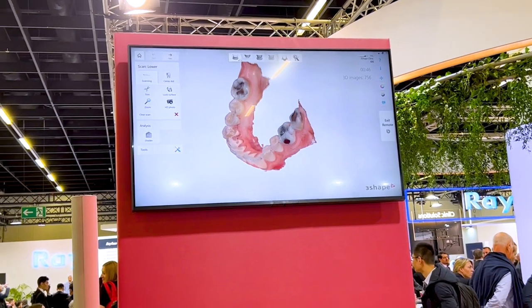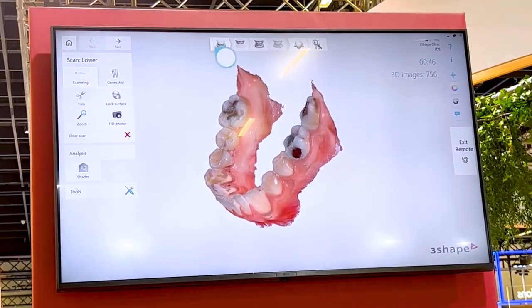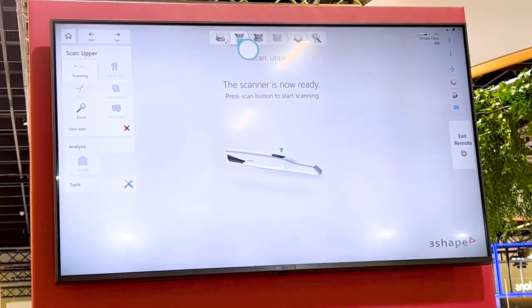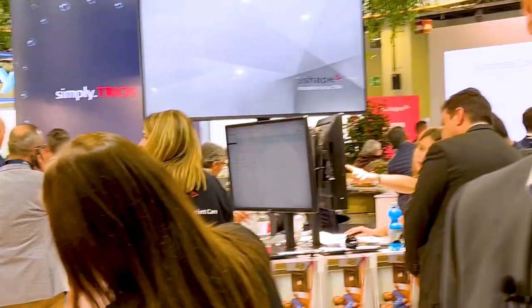You can also see there are some fillings here that give other scanners problems. We never scan on models — we always scan in the mouth as a dentist would do in real life. Thank you so much, hope you love the 3S5. Have a great show.